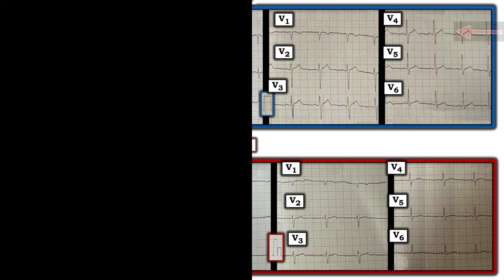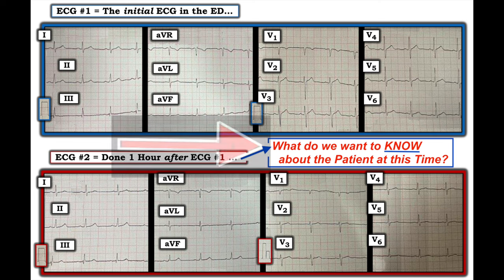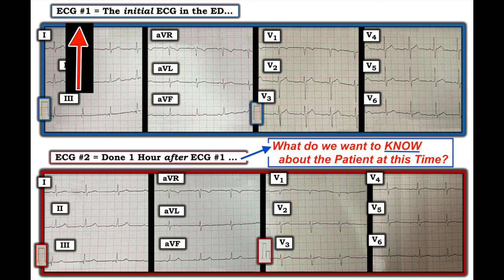Look at the relative height of the ST segments and T waves here versus here. What's the difference? What do we want to know about the patient at this time? What we want to know is if this patient is still having chest pain, right? The patient had chest pain here.